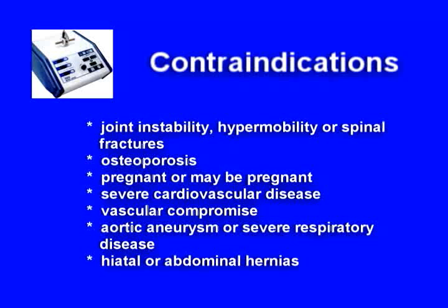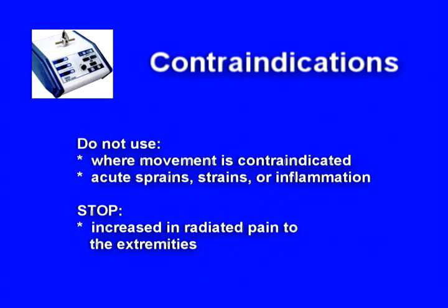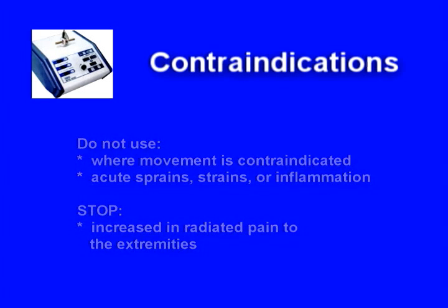or abdominal hernias. Do not use traction on patients where movement is contraindicated or with patients having acute sprains, strains, or inflammation that could be aggravated with traction. Stop traction immediately if there is an increase in radiated pain to the extremities.